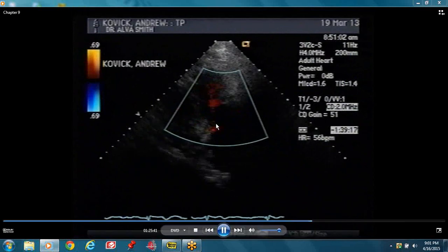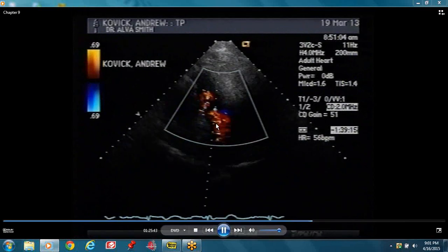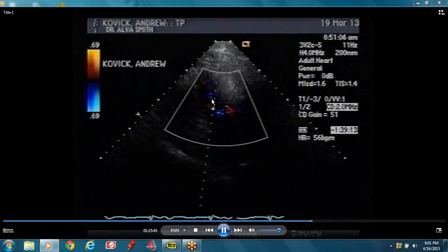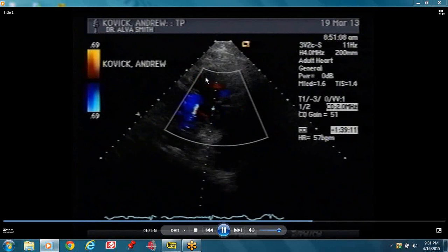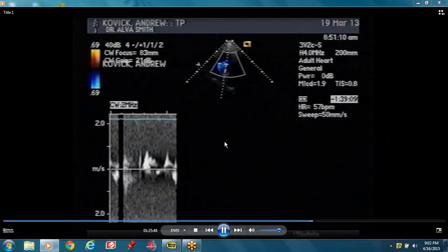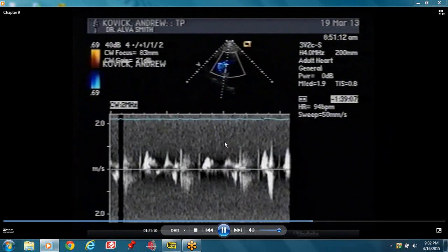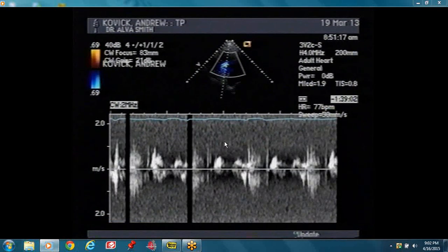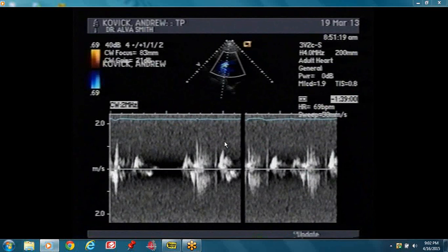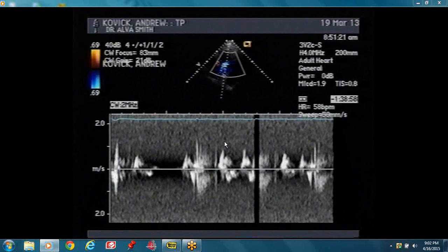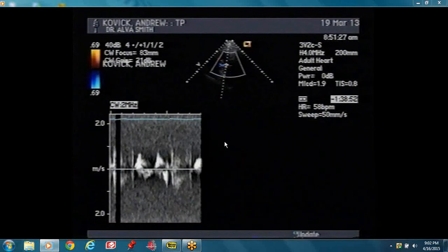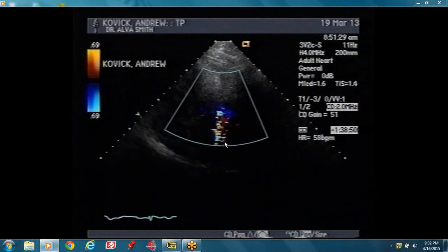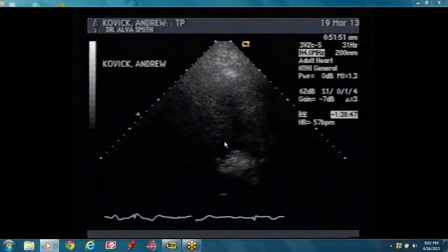This is our RV inflow view — RV is there, right atrium is down there. Develop a routine that encompasses all your measurements so that you don't have to go back. Develop a routine that encompasses all the measurements.